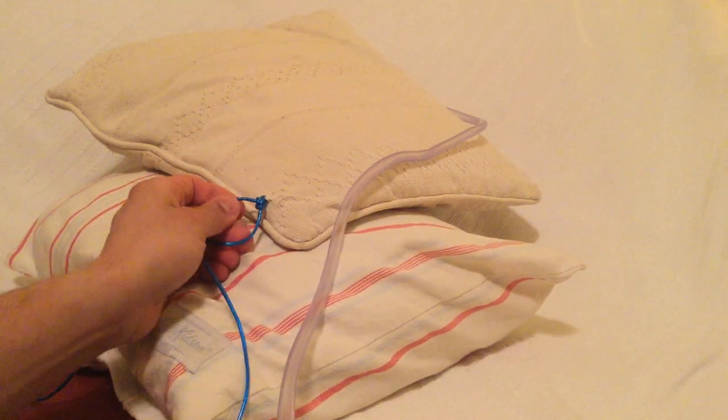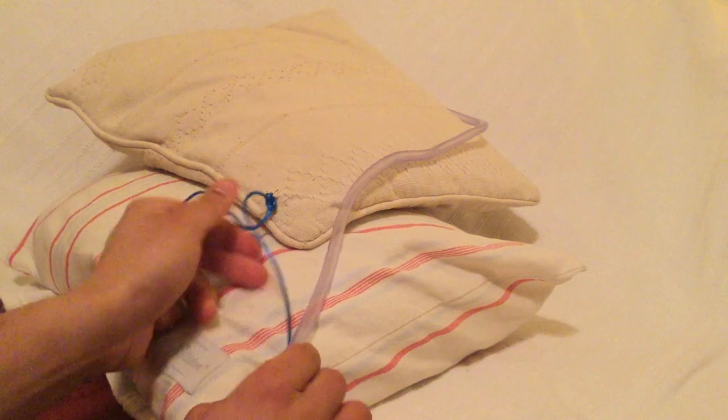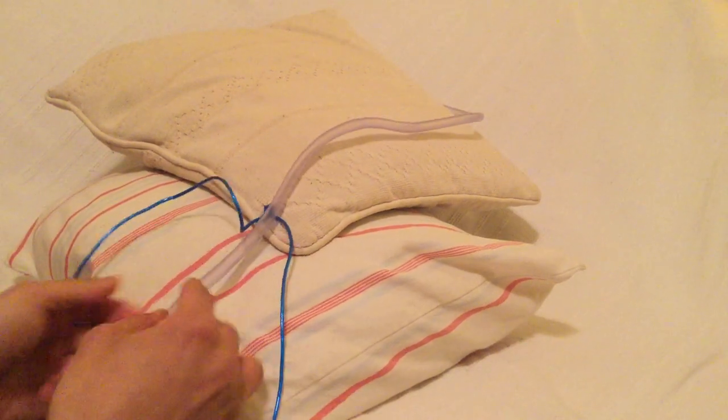As you can see, we have already secured it to our mock-up of the skin and we will proceed by placing the drain in between the ties.